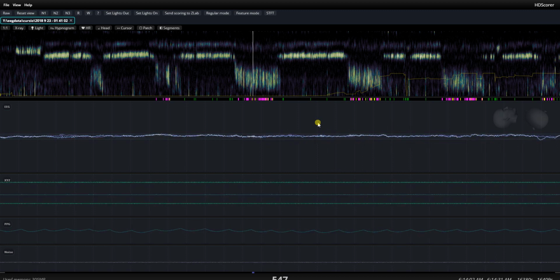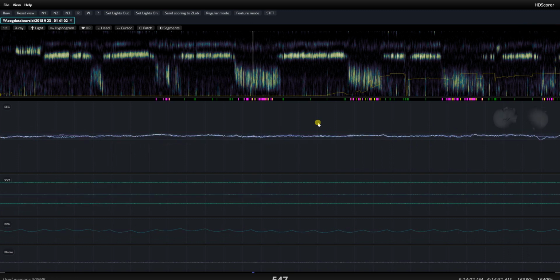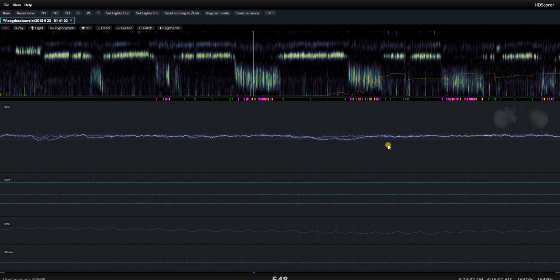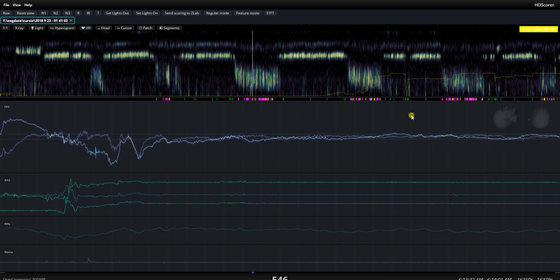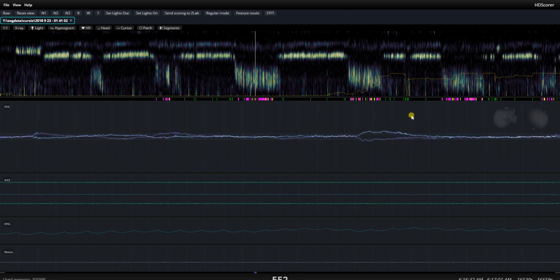In fact, you begin dreaming again. Let's see how long after the audio stimulation you begin dreaming again. 1 minute, 1 minute and a half. I think these might already be eye movements. 2 minutes, very strong eye movements begin again. So you have 2 minutes from the stimulation and you're already pretty much drowsy and having slow eye movements. And yeah, you have 2 minutes until, again, falling back into REM sleep.